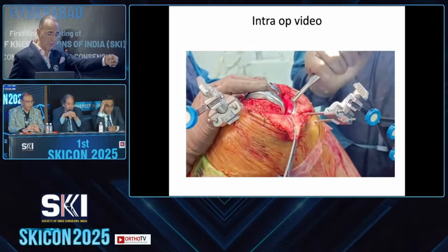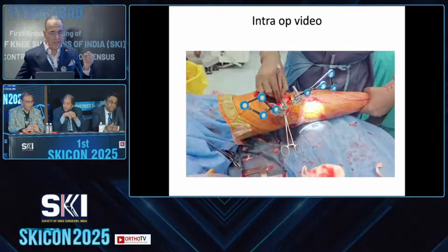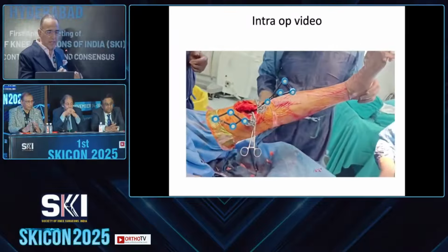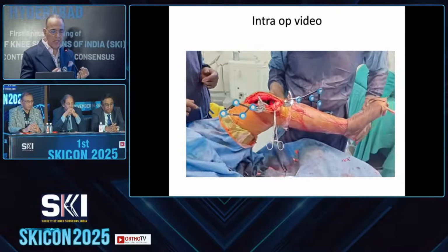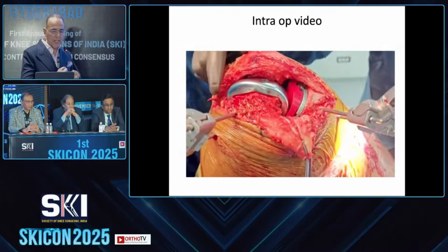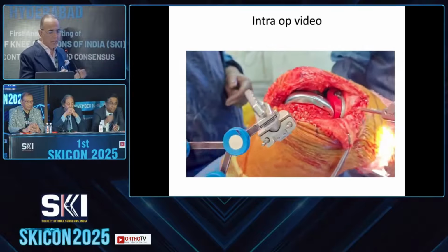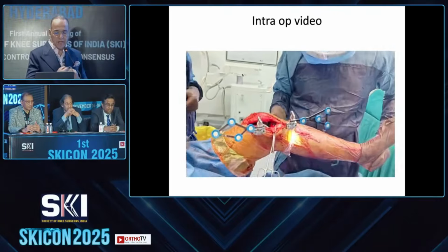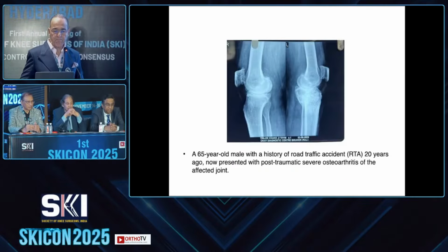Now, please see if this is acceptable. I would say so. Yeah, this is acceptable. So medial, it should be a solid medial ball and socket, and there should be no anterior drawer. Now you can see that my knee is very solid in coronal, sagittal, and axial plane. There is no anterior drawer, and I've changed the poly to anterior stabilized. So that kind of medial snug poly is very important for the patient to go up and down stairs smoothly.